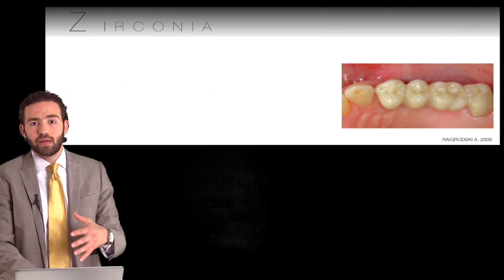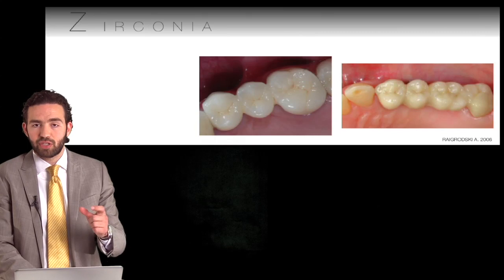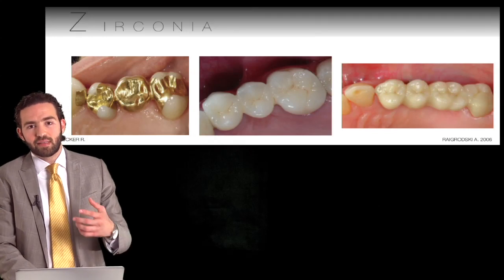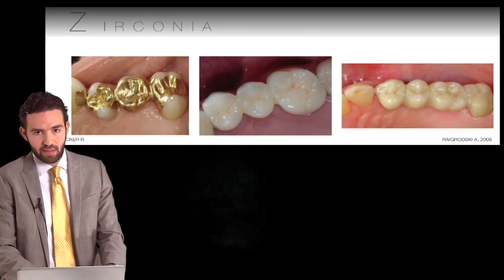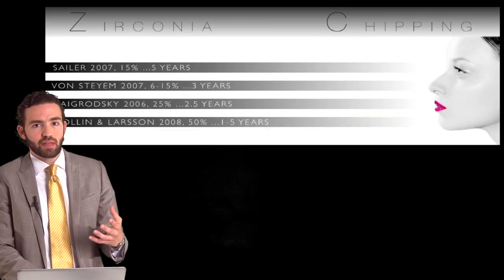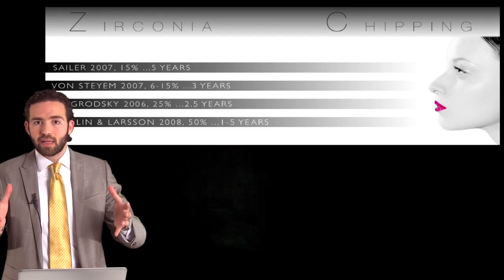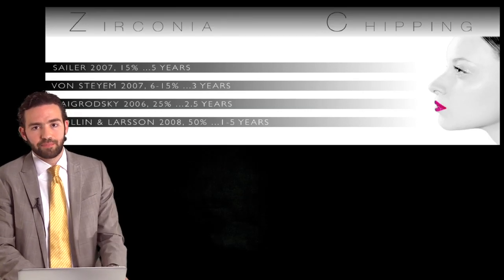When you compare it to regular porcelain fused to metal bridge, you see the connectors are much less because the metal is much stronger. And of course, when we compare it to the gold restorations, the connectors are much, much smaller because we don't have to really provide space for the ceramics. So everything is trying to make sense now in terms of the connectors, that when we go towards all ceramics used on fixed partial dentures, you have to provide big, thick connectors that oftentimes are biologically unacceptable.